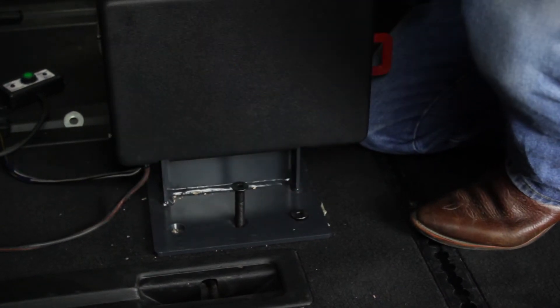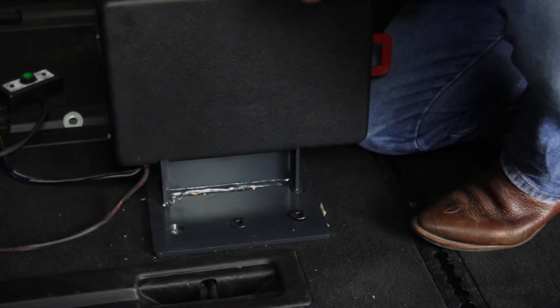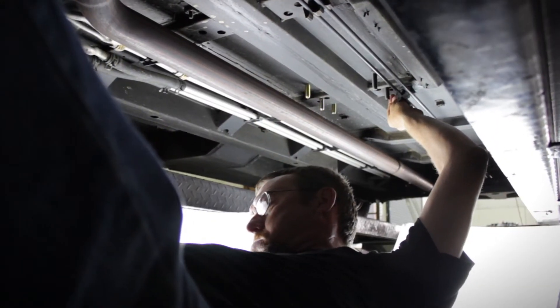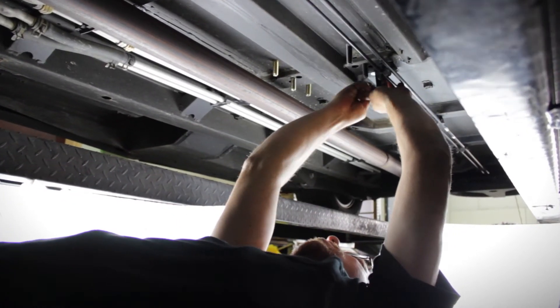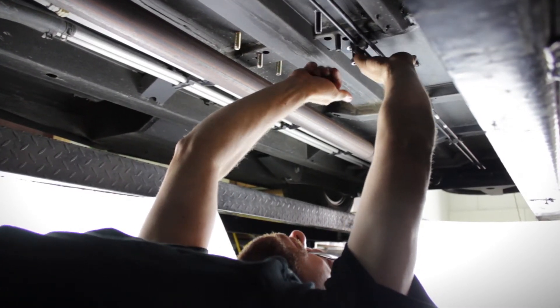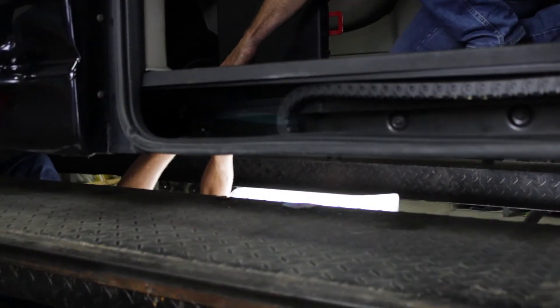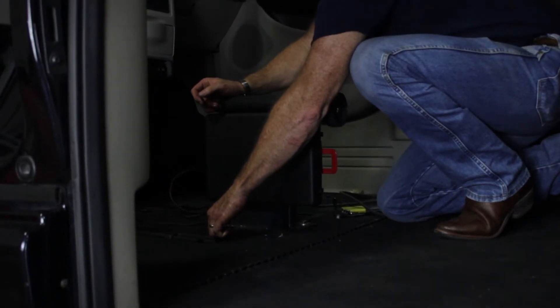Utilize the provided bolts to keep the Hightower Docking Station in place while you conduct the next step of the installation. Utilizing the six sets of provided washers and nuts, attach all washers and nuts and tighten down the bolts holding the Hightower Docking Station to the floor. Once all six sets of provided washers and nuts have been attached, utilize the help of another to tighten them down.